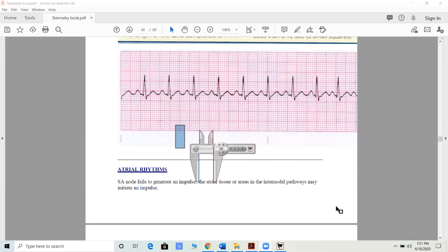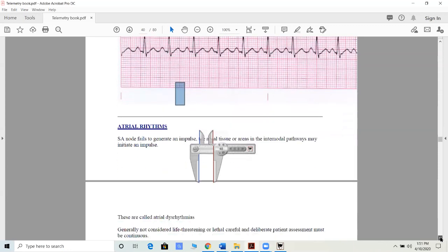Now, 120 is not abnormal to the point that in our daily lives we don't get our heart rate up there, but it's transient, right? We don't stay at 120 24/7. So you need to think about these things. What happens if, okay? Why is this bad? Because there's no resting. There's really not a lot of time to rest in between heartbeats.